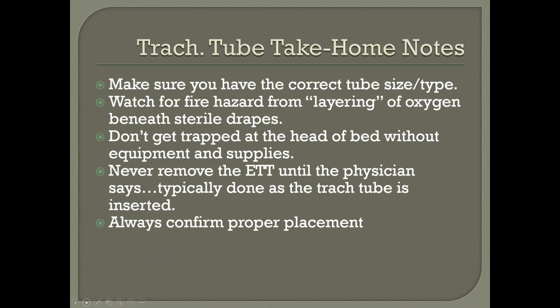It's not common, but it has happened. If you go in the literature, you're going to see individuals who have their necks burnt. They're not dead, and many times the flame does not go into the patient's lungs, but it will be a skin burn type of deal. It's still a potentially avoidable hazard or complication.